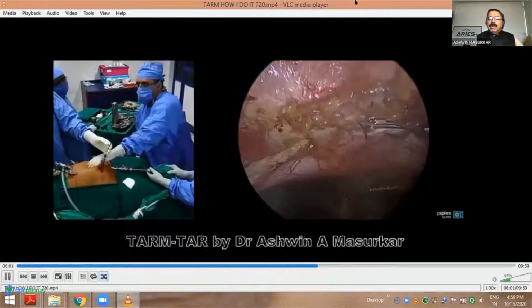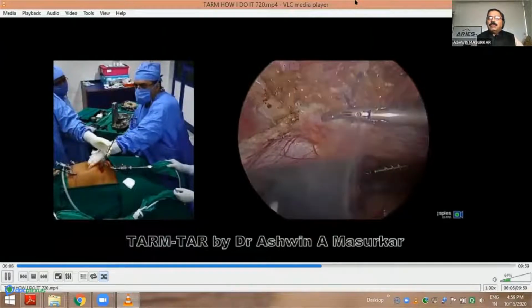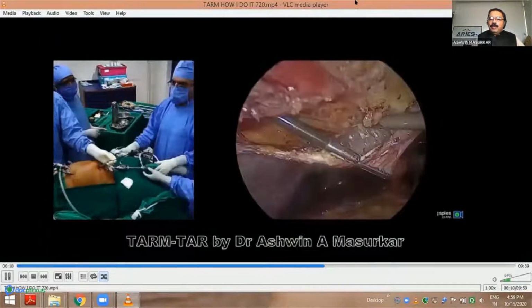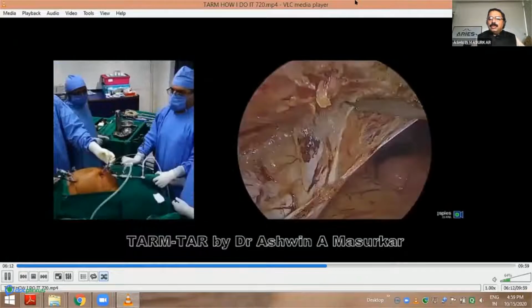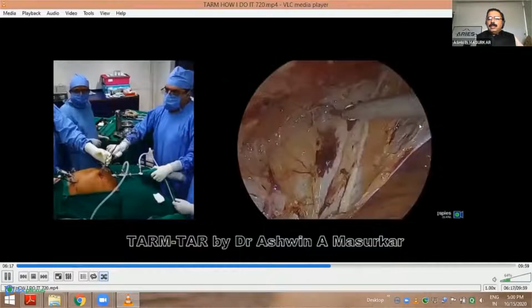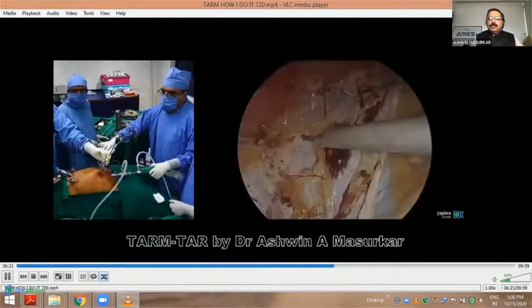Now in the midline, one must be in the preperitoneal space rather than trying to be retrorectus, because otherwise you can very easily take down the linea alba along with this flap. And this is the important thing that you should see. You can see a bridge of peritoneum with the preperitoneal pad of fat. The lateral extent is to stop at the linea semilunaris.